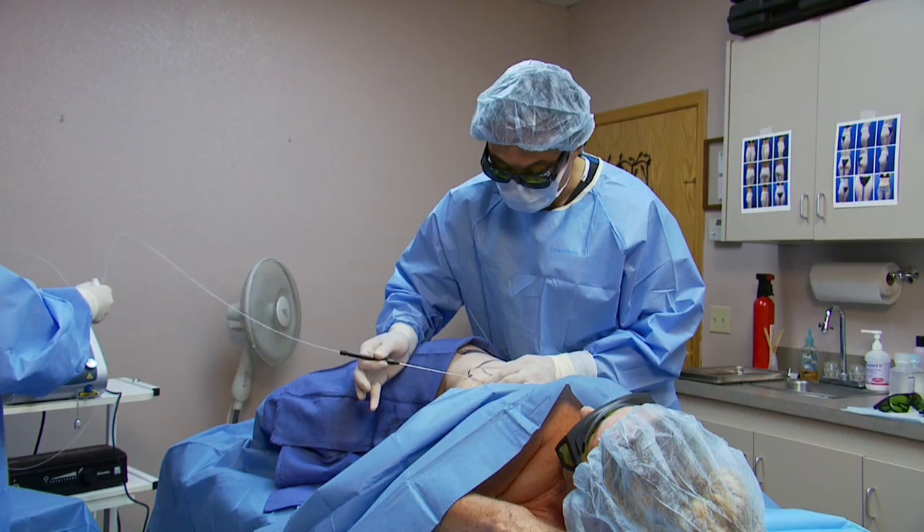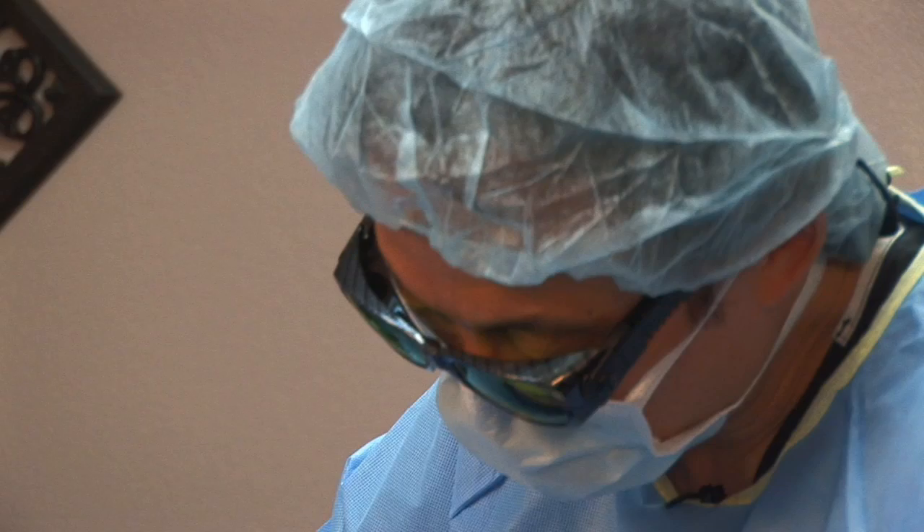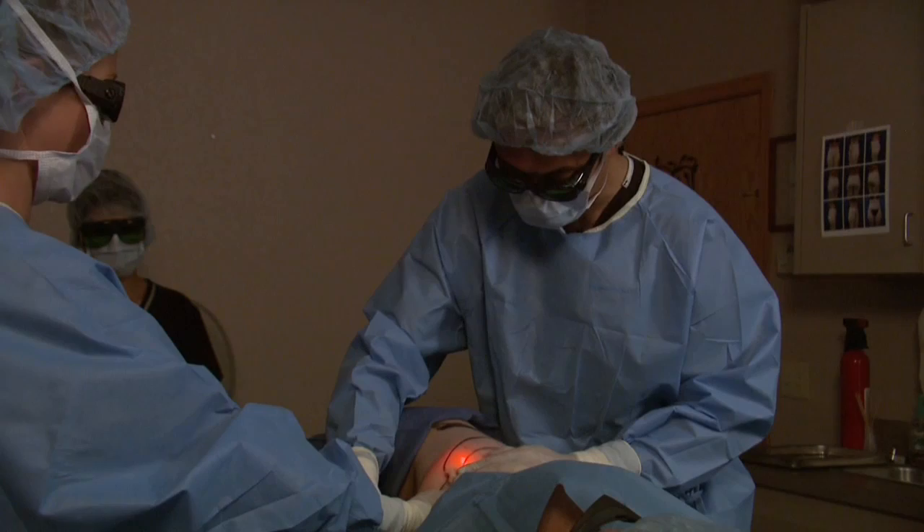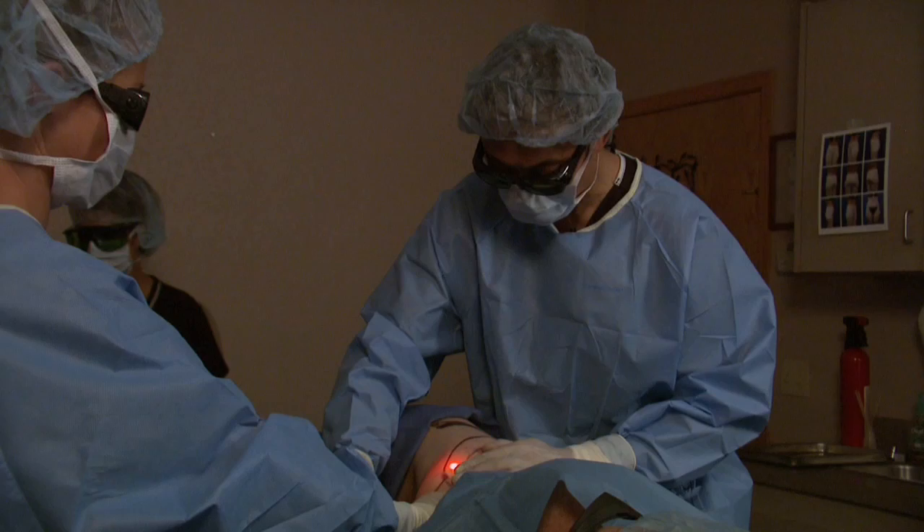Let's go ahead and turn the laser on now. Lights off. Laser on. We're just passing the laser fiber under the subdermal plane and going slowly — we want to just go slowly. Our tendency is to want to move back and forth in a fashion like this. And again, this is going to give her a great butt lift as well as remove this unwanted muffin top or flank area.